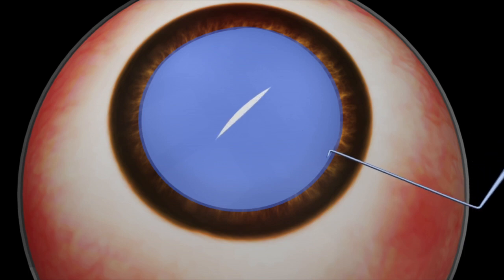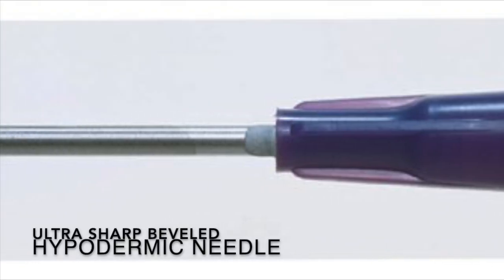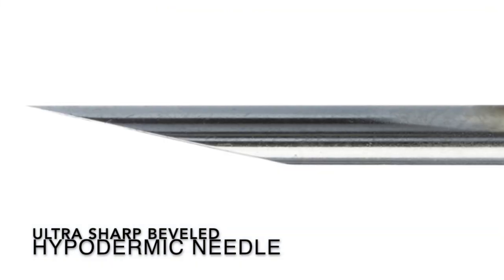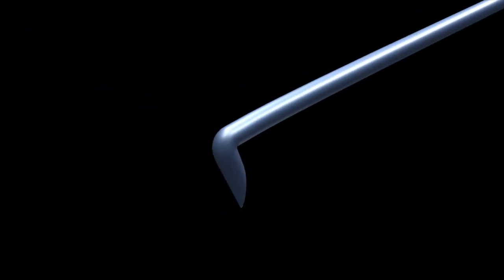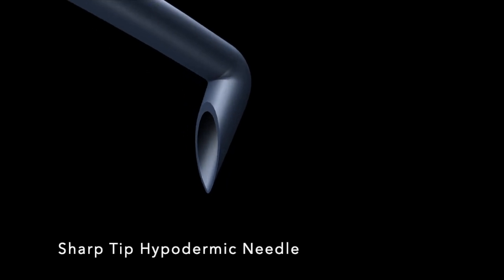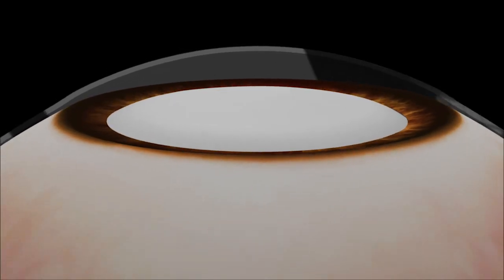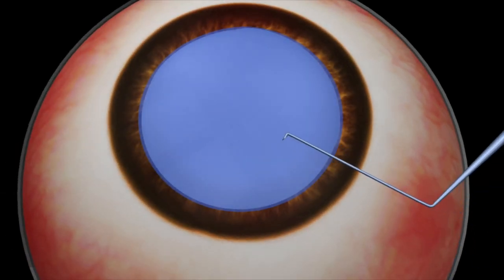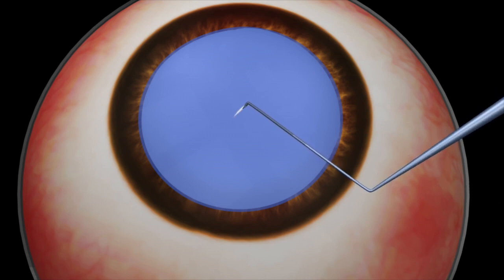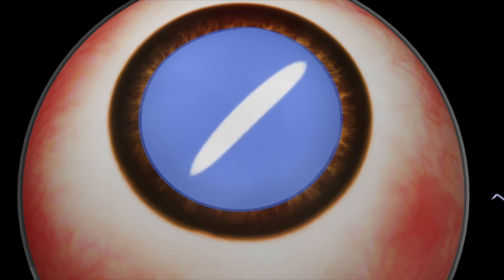This splitting force divides the initial slit into a complete anterior capsular tear. It is the ultra sharp stainless steel hypodermic needle or sharp tip capsular rhexis forceps, when piercing the anterior capsule, that results in a small linear cut with open edges. Here you can see how the needle creates a slit in the anterior capsule. The discontinuous linear cut over the stretched tight anterior capsule with underlying high intralenticular pressure tends to easily diverge along the open edges and rapidly radialize to the periphery in an undesired and uncontrolled fashion, resulting in the Argentinian flag sign.